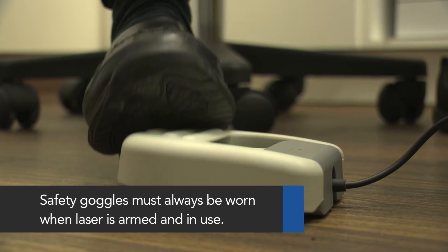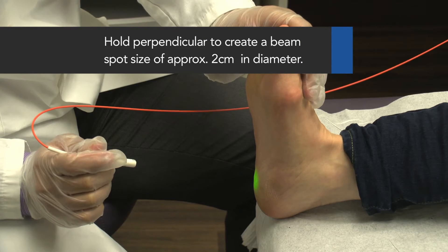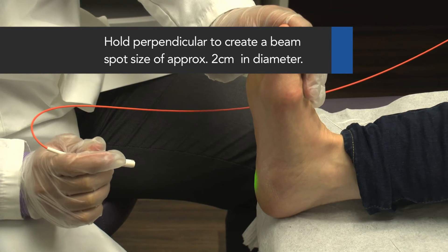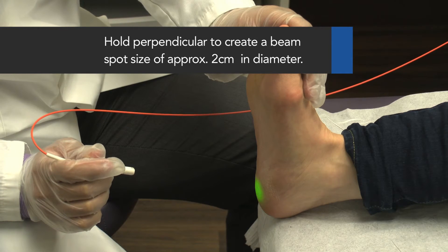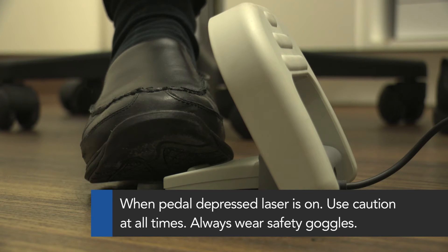Next, open the safety cover on the foot pedal. Make sure the handpiece and indicator light are pointed at the area to be treated. Hold to create a beam spot size with a 2 cm diameter. Depress the foot pedal to turn the laser on.